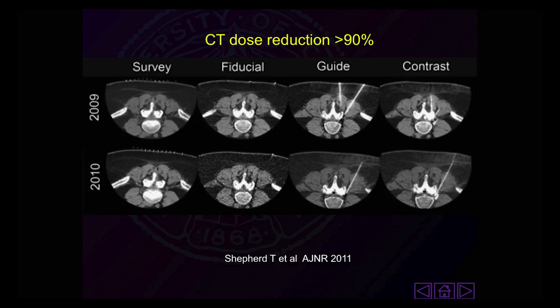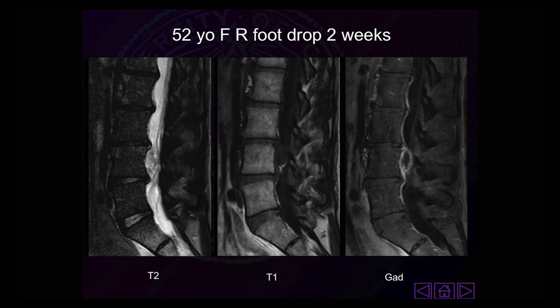And so we continue to push the envelope, lowering dose so that it would be comparable or even less than normal X-ray guidance. So what do we do with these injections? We can treat entities that you've heard about earlier. Here's a patient with a huge, huge disc.